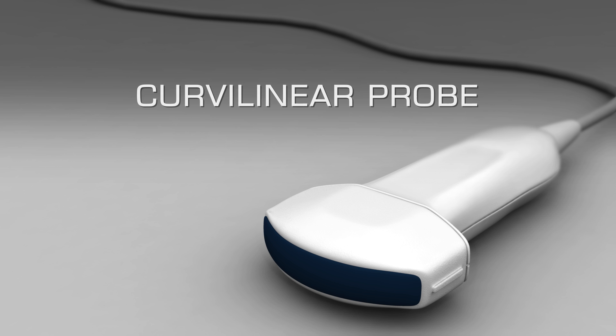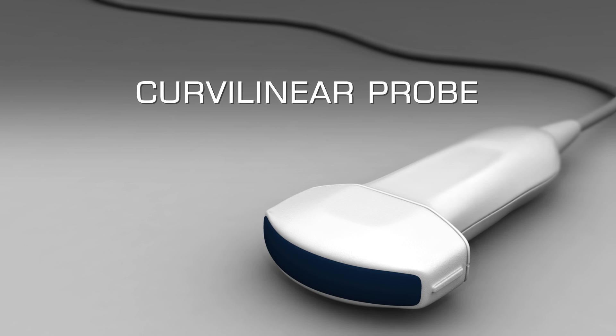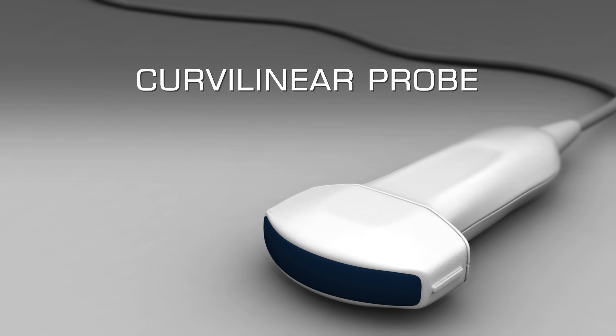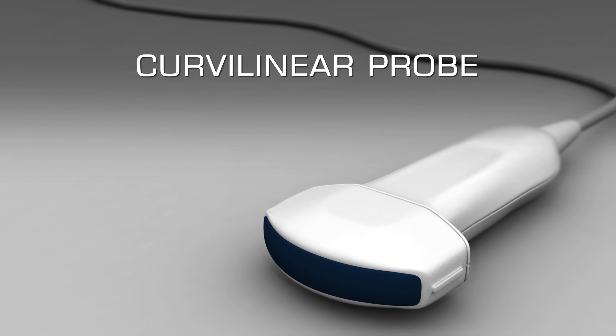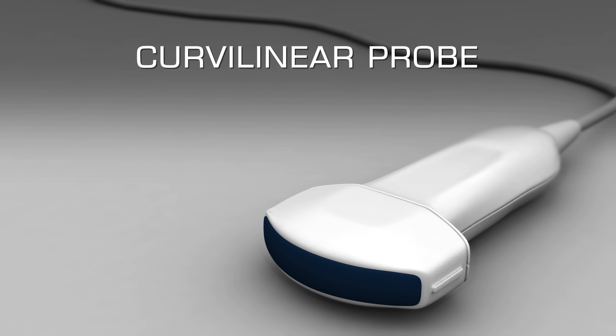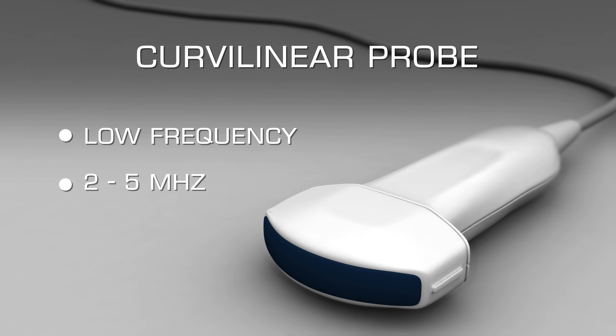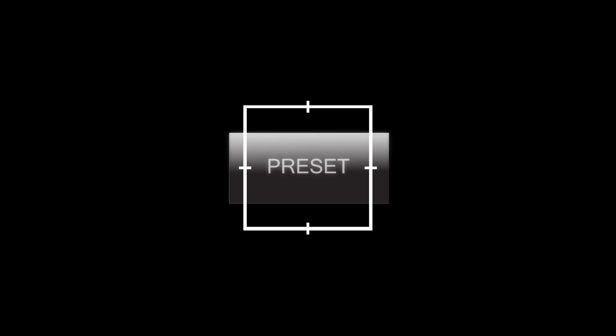The ideal transducer for assessing structures within the abdomen is a curvilinear array probe with a frequency range of 2 to 5 megahertz. Select the abdomen preset on the ultrasound device.